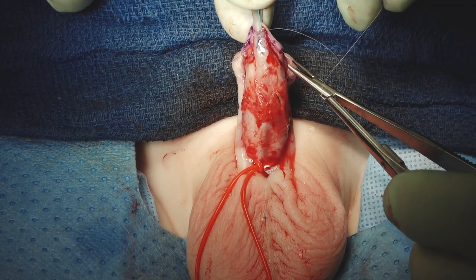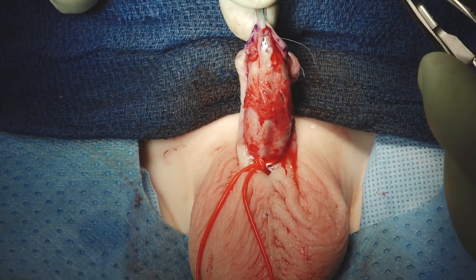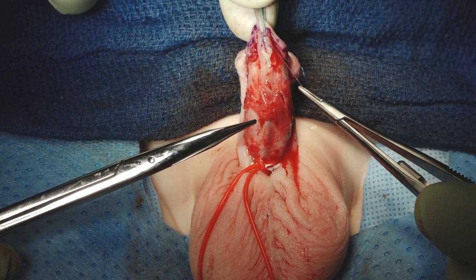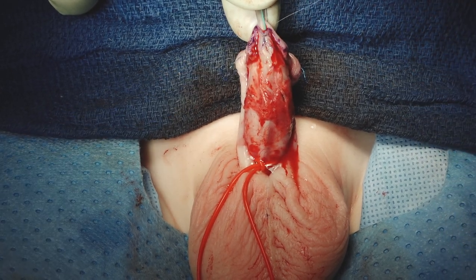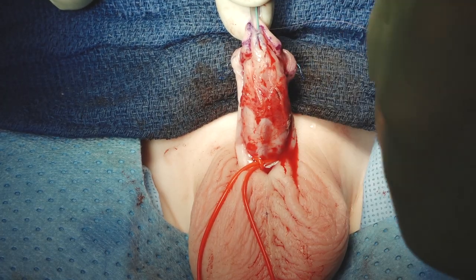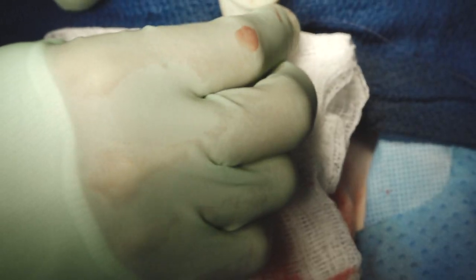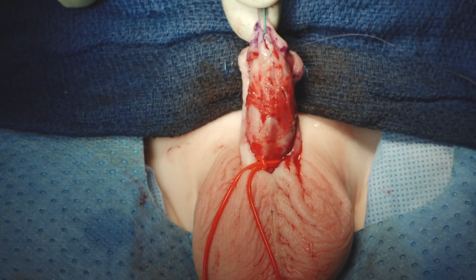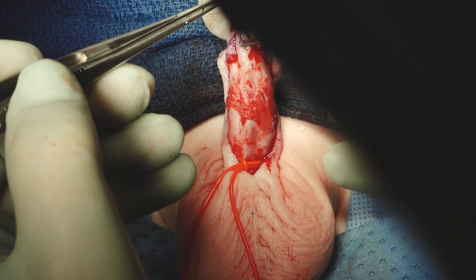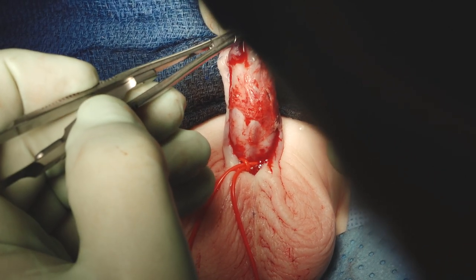You've read from us many times that the opening on the urethral plate should be oval and not round — and you see that's exactly what it is: oval, not round. In a distal repair, we run this stitch down. Our first suture distally was epithelial, because it's so important to get that at the exact right spot and not take it out too far distally. But all the rest of our sutures will be sub-epithelial.